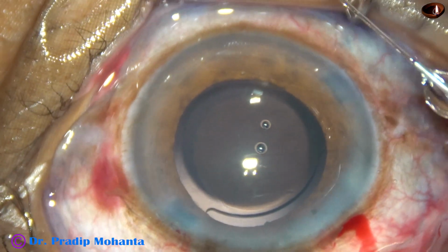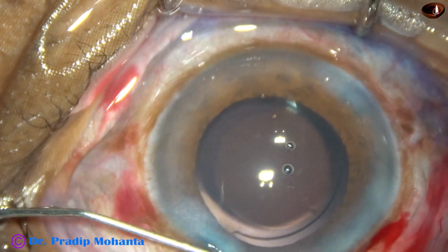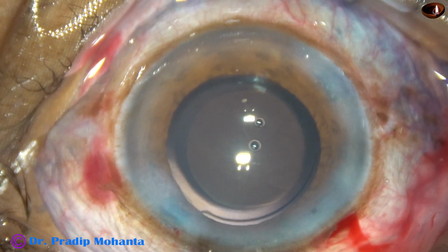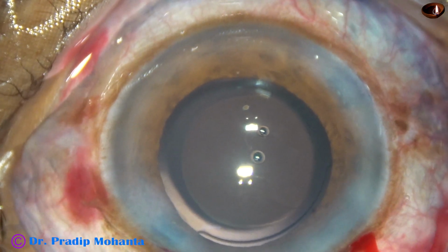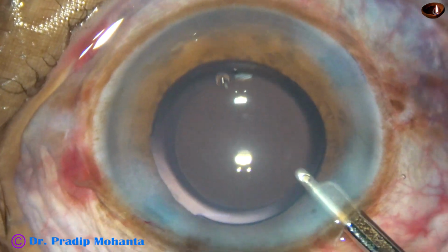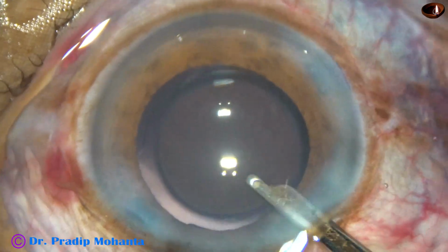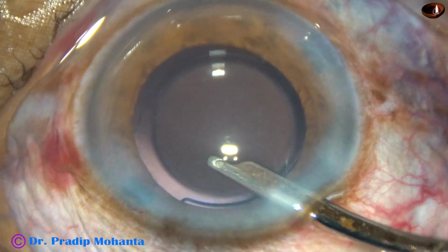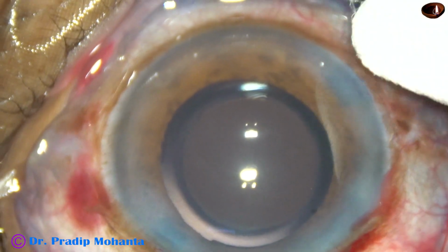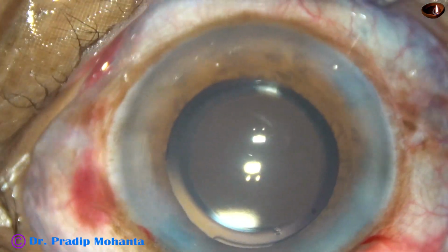This is a bit of moxifloxacin. Now the side ports are hydrated with BSS. BSS is used to hydrate corneal stroma on either side of these side ports. And then this is the final lavage of the anterior chamber. Watch the visco from the posterior surface of the cornea. From corneal endothelium, visco comes out at this time. A gentle stream is irrigated towards the cornea, and this can be done very nicely with the Simcoe. Cleaning of visco from corneal endothelium. All the wounds are nicely checked. A few drops of moxi are applied over the cornea, and then the case is concluded.